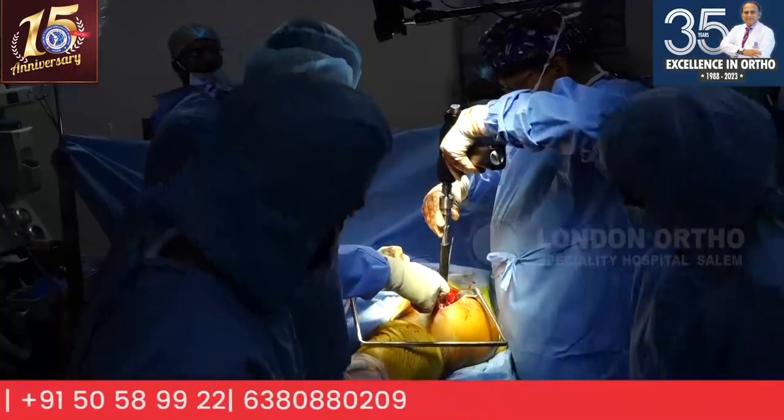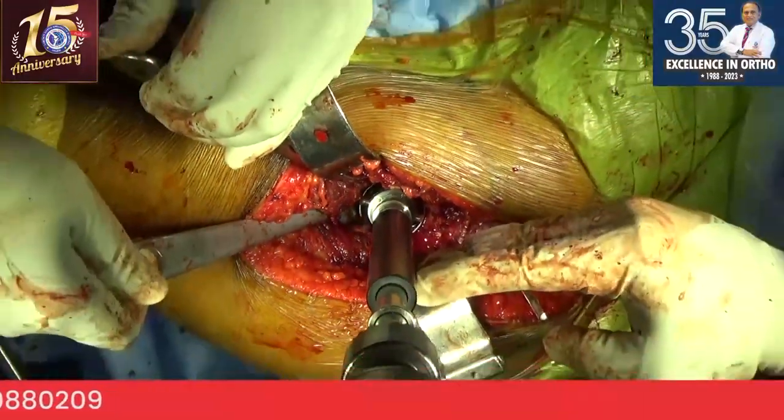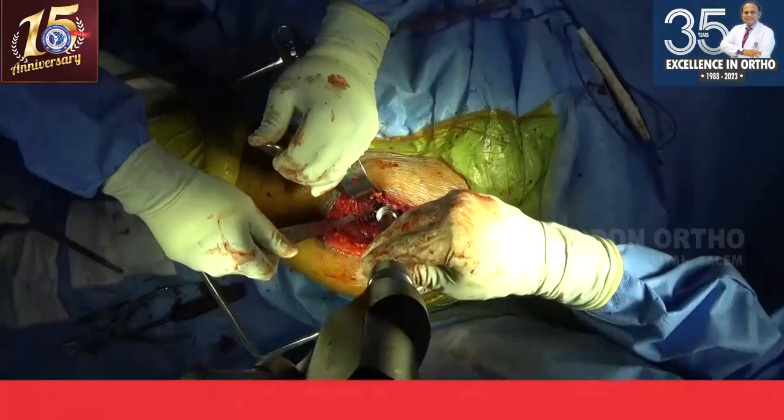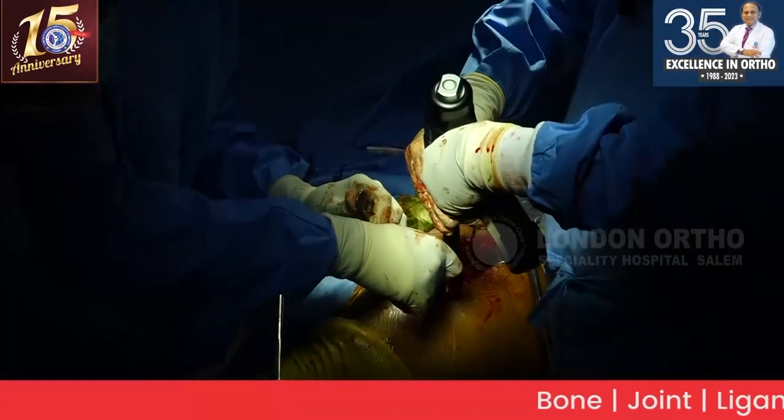So that's for the beginners. See, that goes parallel with my Steinmann pin. That's a neutral. From here, 10 to 15 degrees anteversion. That's the inclination. Okay.